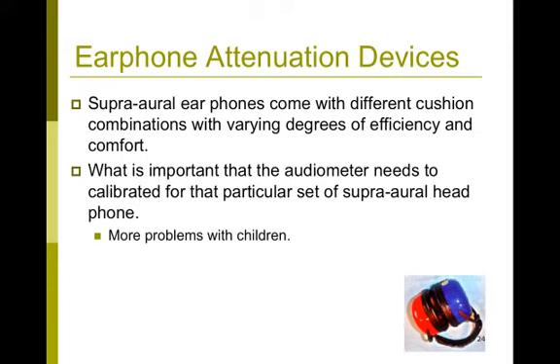Another important point you need to remember is that audiometers are calibrated for that specific headphone. So if you find yourself working in a clinic that has a number of audiometers, just because the earphones look alike doesn't mean that you can switch them. Because when they were calibrated, it was calibrated for that pair of audiometer and headphones.